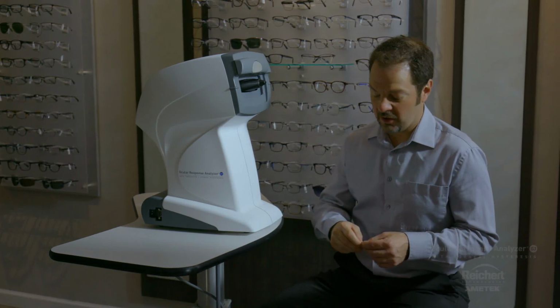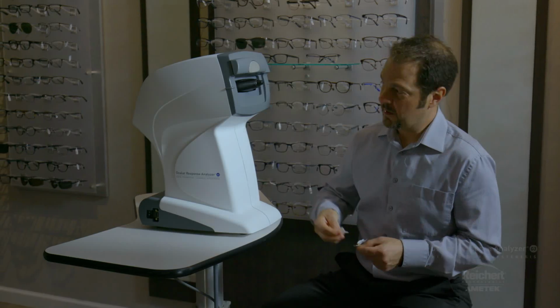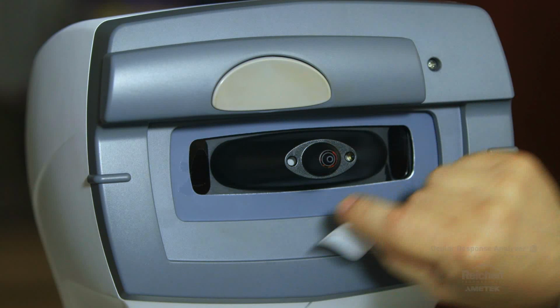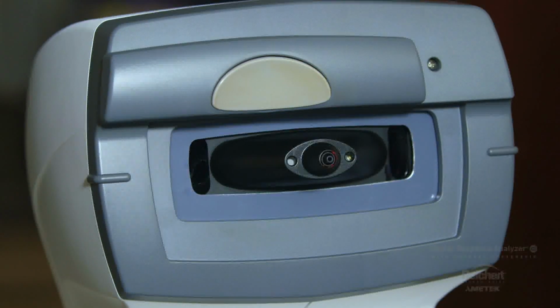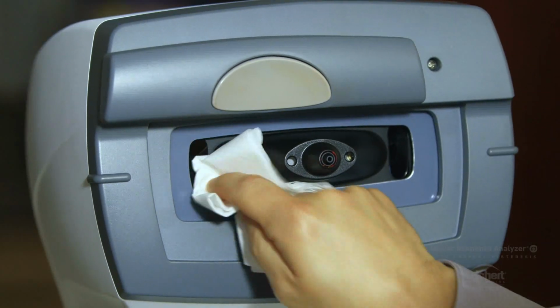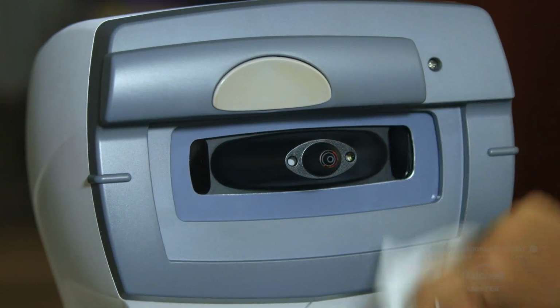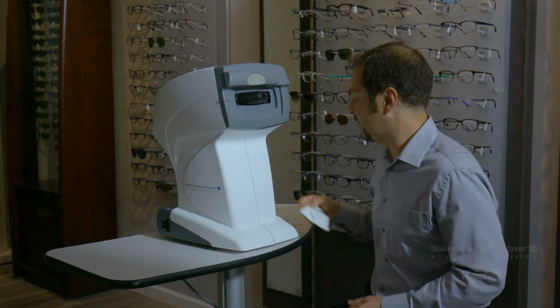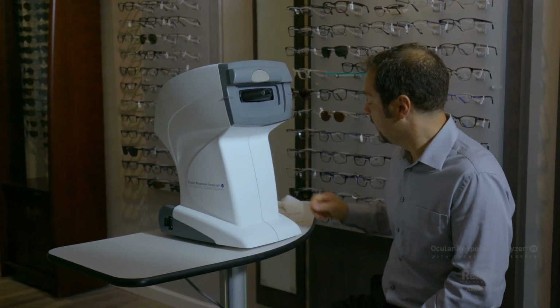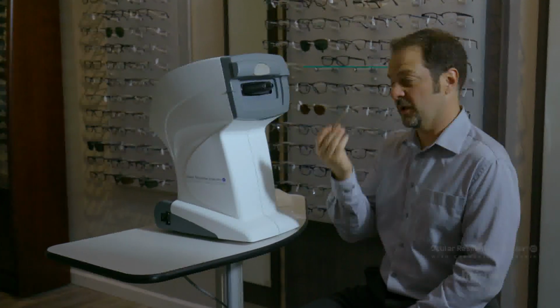I like to just use alcohol wipes to clean the alignment windows on the outside. So just grab yourself some isopropyl alcohol, wipe those windows off, get all the tear film and any other dust or anything that's on there, and then use a lint-free cloth like a Kim wipe or something of that nature to dry any residue off so that you don't get any haze. Those surfaces need to be mirror-like, so you want to inspect them closely after you've cleaned them. If you need to use a pen light or a cell phone light to get a good look at them, please do that.